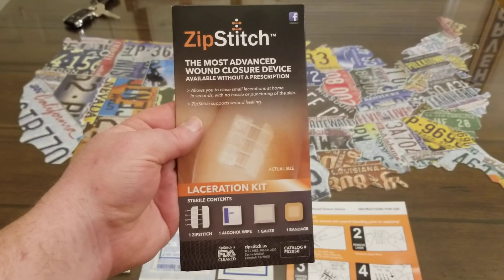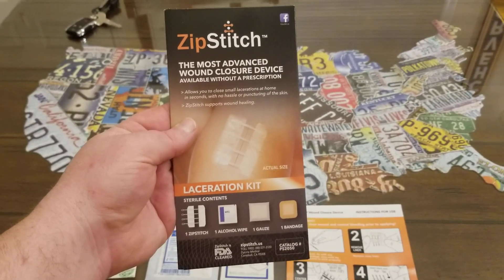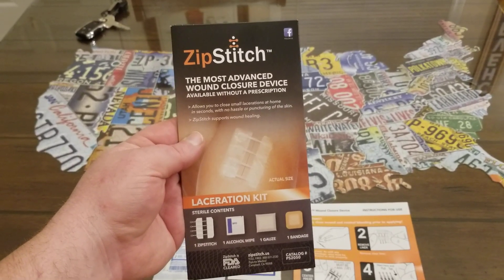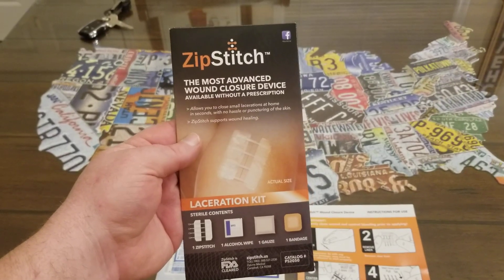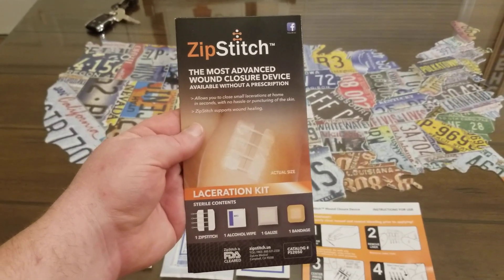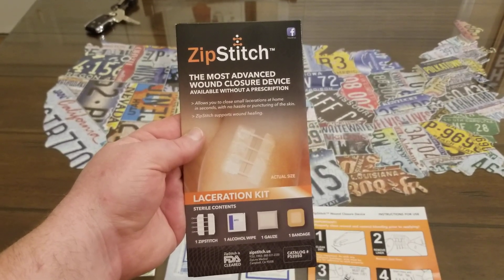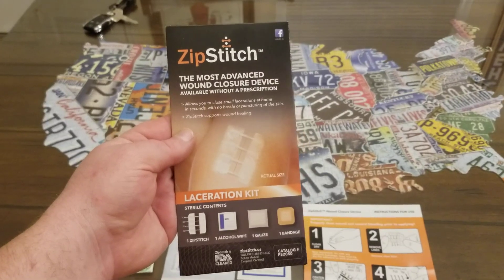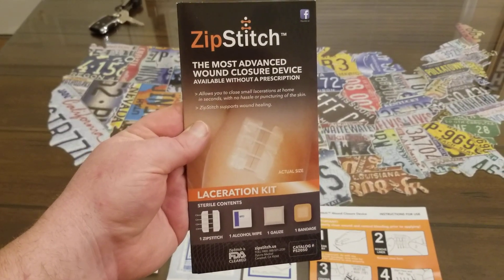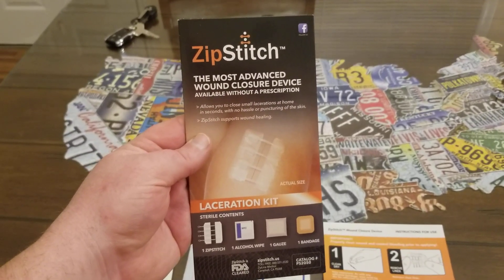Hey YouTubers, got another video review for you today. This one's from a company by the name of ZipStitch. I was walking around Walmart one day and I happened to bump into a gentleman. We got to talking — he worked in the sporting goods department — and one thing led to the next. I told him I was a YouTuber who reviewed products and he asked if I'd ever reviewed ZipStitch. I said no, never heard of it. He told me about it, I went home, looked it up, and was completely impressed, so I reached out to the company and got a few of these babies.